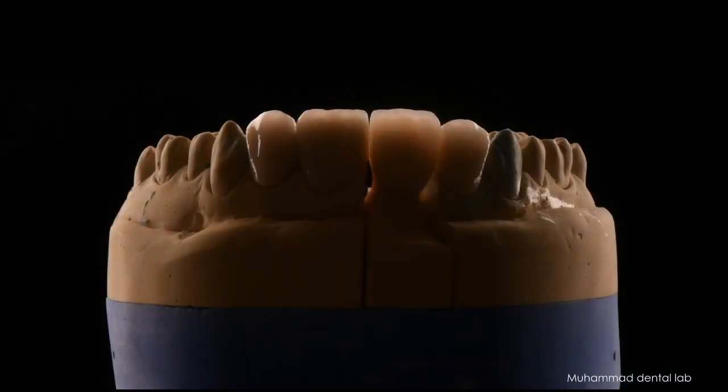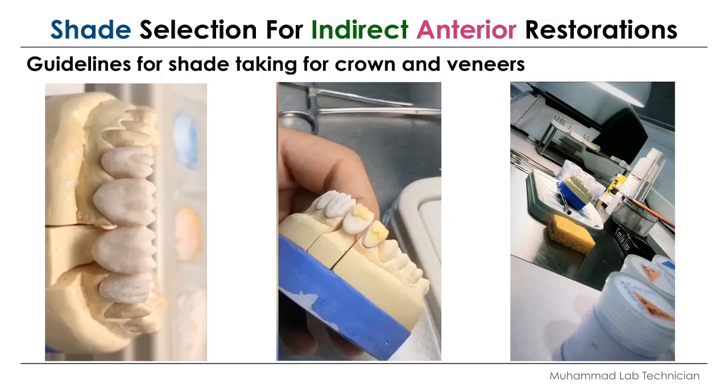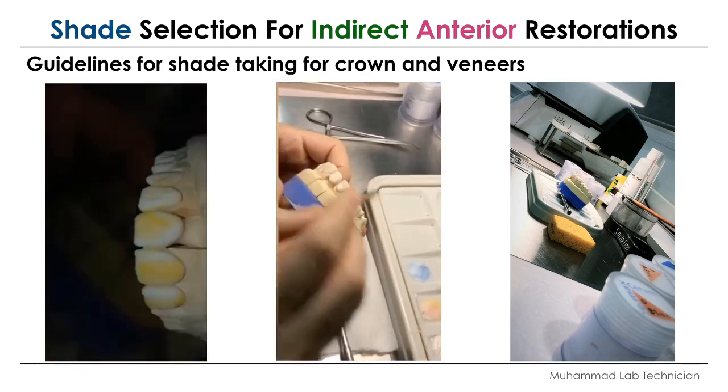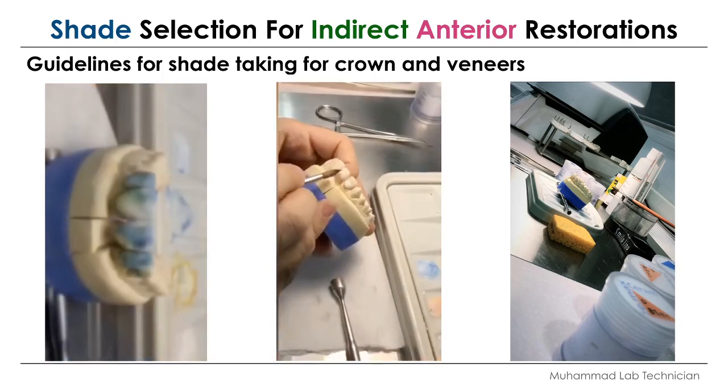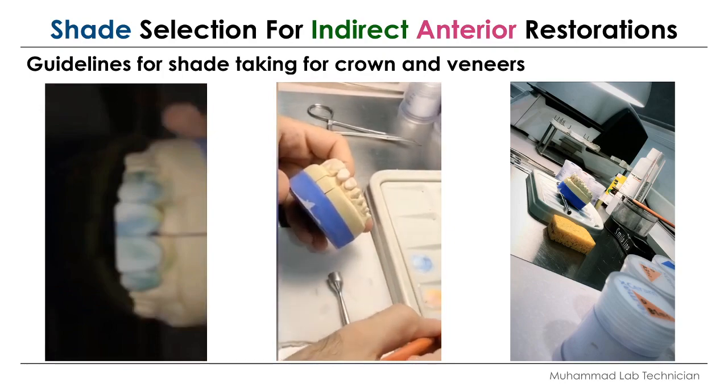A minimum zirconia thickness of 1.1 millimeters is essential for color match. Newer generation all-ceramic systems and adhesive cements allow dentists to use a minimally invasive approach and make thinner restorations, maybe 1 to 1.5 millimeters. So we can see here how the color of monolithic restorations may be influenced by the manufacturing of the lab process, the background, the cement, and restoration features. We can see here my dental lab office and how it's going to make the translucency, thickness, shade, surface texture, glaze, and contour.